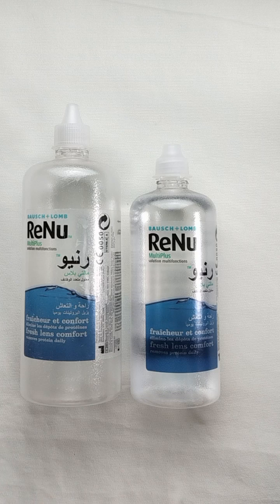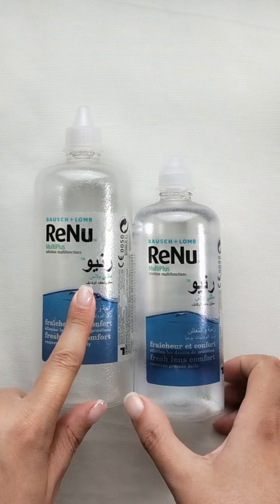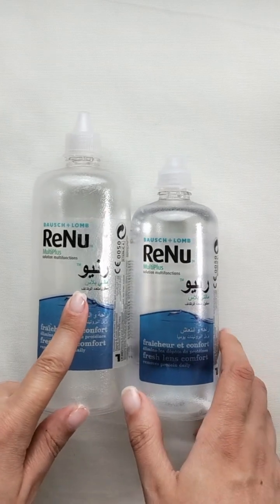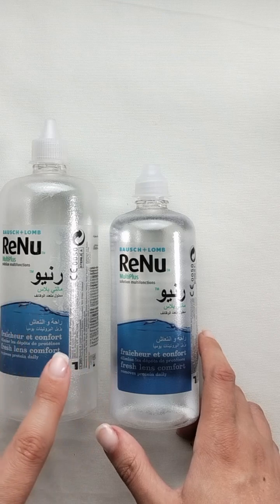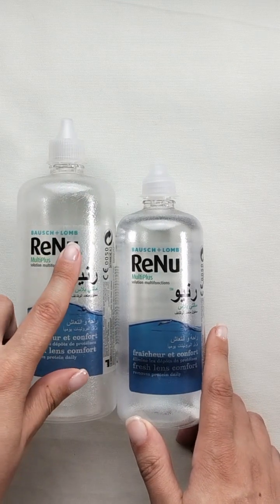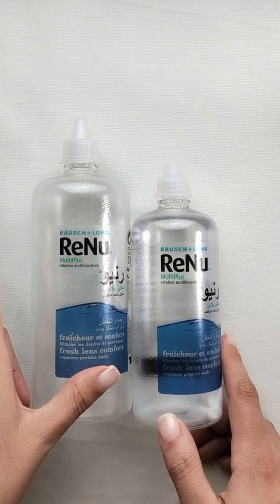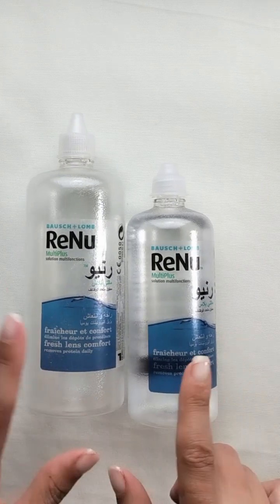Hi everyone, welcome back to another quickie review. In this video we're going to talk about the Renu — or Renu, whatever you call it, I don't know how to pronounce it — but anyway, this is a contact lens cleaning solution. It's from Bausch + Lomb.